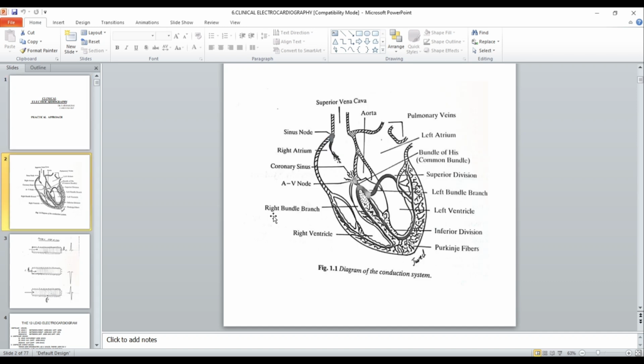Electrocardiography is the graphic recording of the electrical activity of the heart. It is an important diagnostic tool for diagnosis of cardiac diseases, particularly myocardial infarction, various conduction defects, and arrhythmias. It should be kept in mind that an electrocardiogram is not a final parameter for the diagnosis of heart disease. A person with severe heart disease may have a normal electrocardiogram, while a normal person may show non-specific changes in ECG.